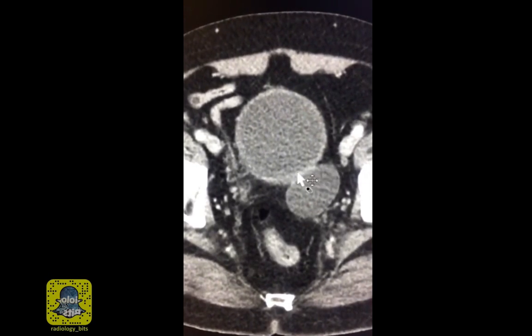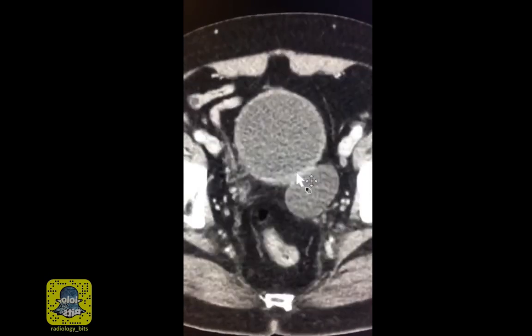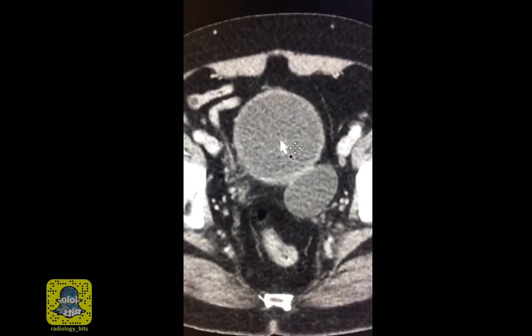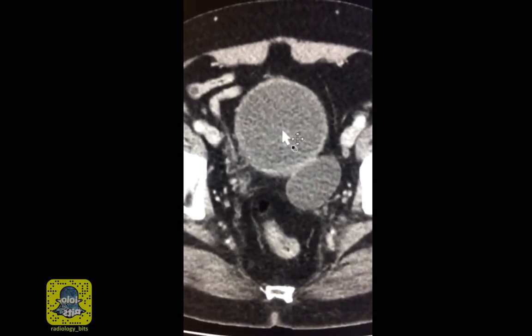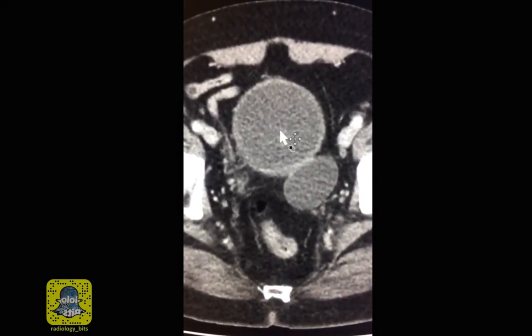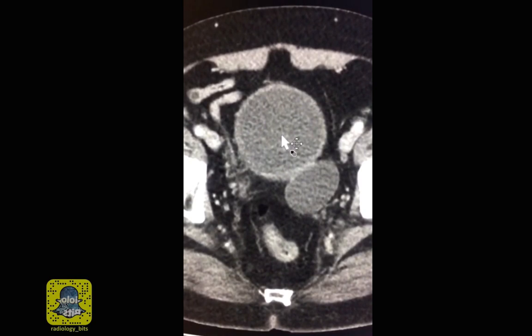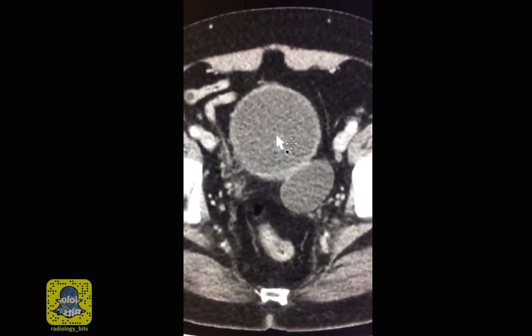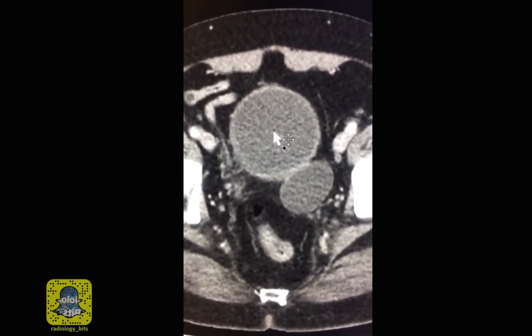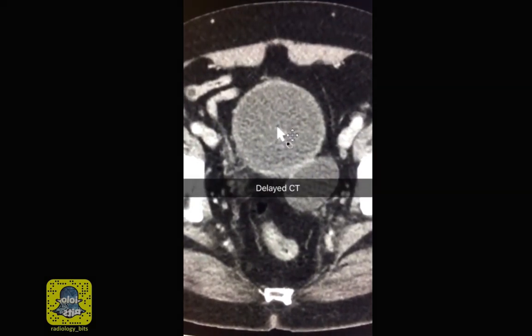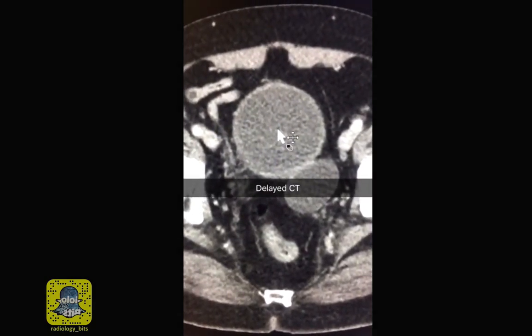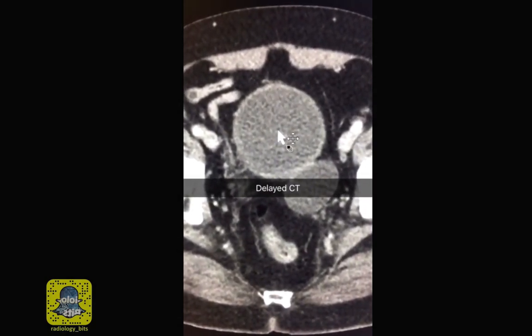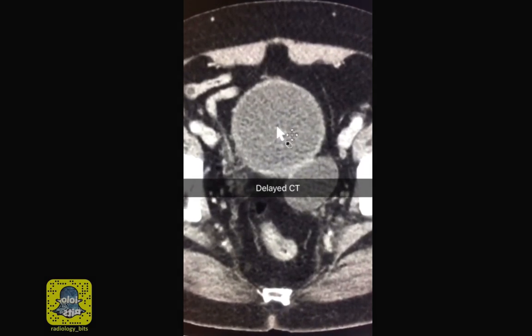You might wonder about some deficiency in the rim here, which could denote communication with the urinary bladder. To confirm this, if it is connected to the urinary bladder you could do one of two things: you could either inject contrast directly into the urinary bladder using a Foley catheter, or with an easier and less invasive way, wait for the IV contrast to reach the kidneys and be excreted into the urinary bladder — in other terms, a delayed CT scan, waiting about three to five minutes after giving IV contrast.